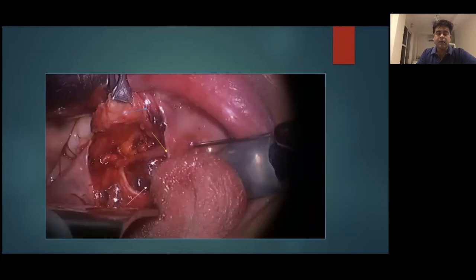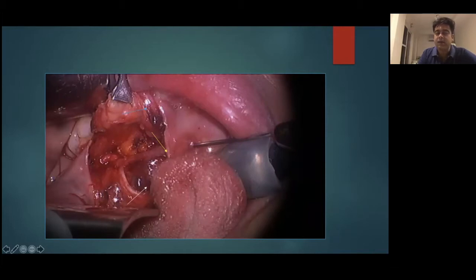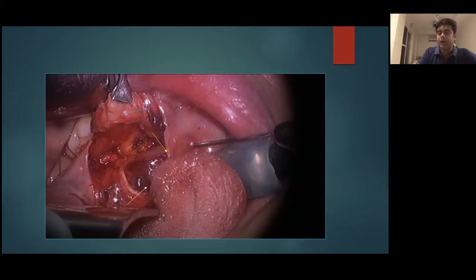There is additional concern for the posterior half because of the complicated anatomy of the floor of the mouth. The yellow arrow marks the duct, the white arrow marks the lingual nerve — which you can see crosses the posterior part of the duct — and the blue arrow marks the sublingual gland, which has been reflected off. In retrospect, the sublingual gland completely hugs the duct, so the duct is quite hidden and protected by vital structures.